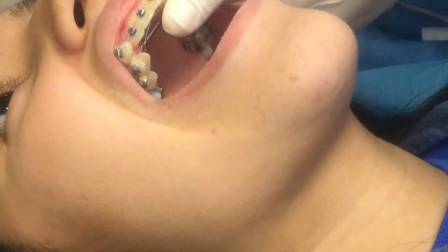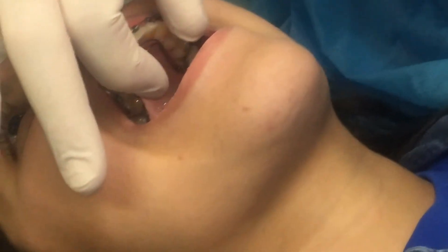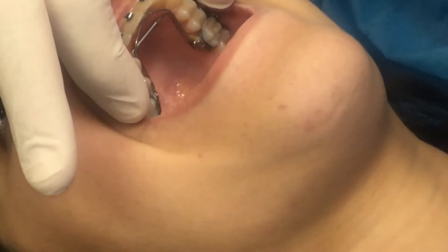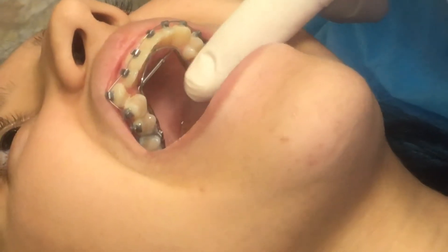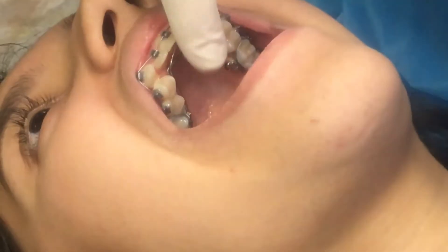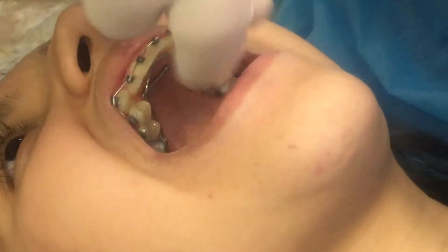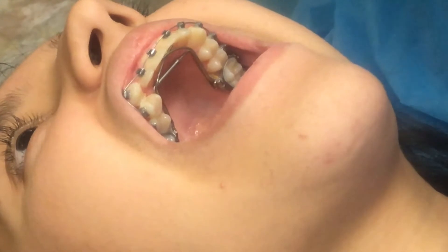You can see these two wires up here in the front — they're actually pushing on these front teeth to kind of get them to go forward, as well as pushing sideways to expand the arch a little bit. Now this little bar does make you talk a little funny, especially at first, but compared to the old palatal expanders where you have that big piece of plastic that goes across your palate and a screw in the center, this is much more comfortable for the patients.